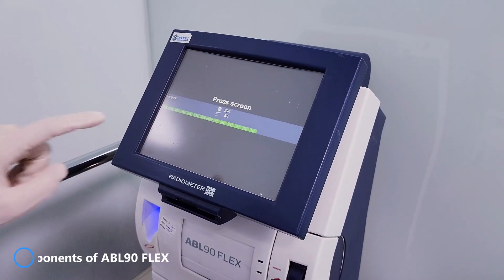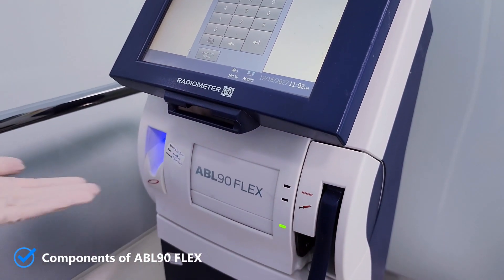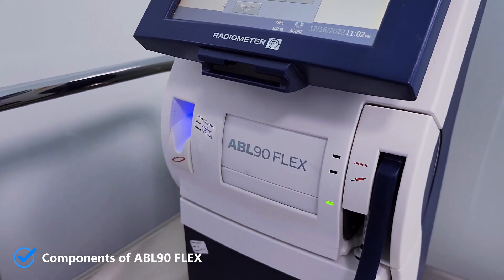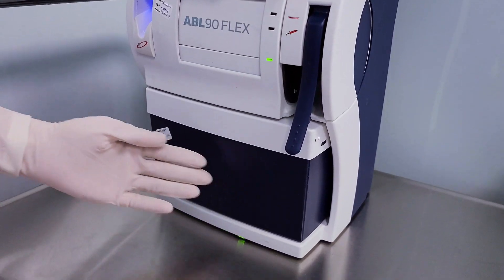The analyzer contains a touch screen, barcode reader, a built-in sample mixer for pico-syringes, a compartment for the sensor cassette, an inlet gasket handle, and a solution pack.